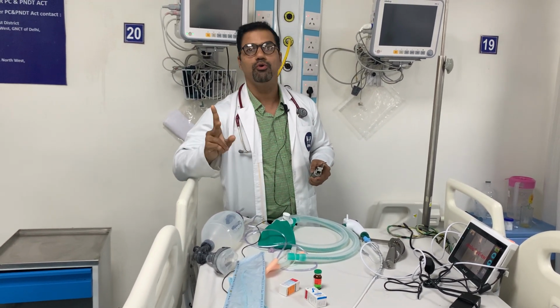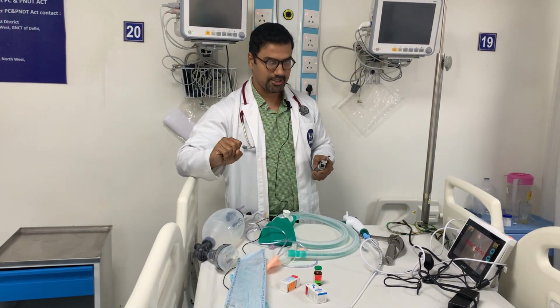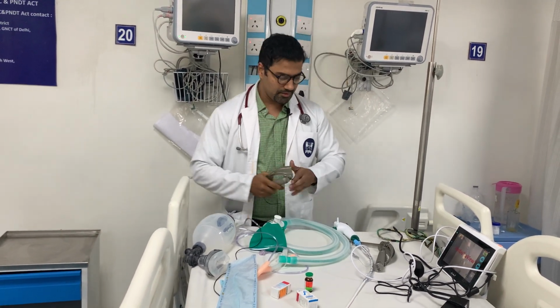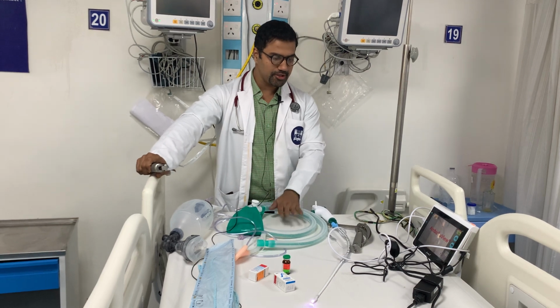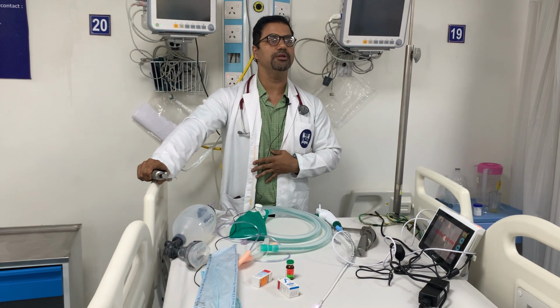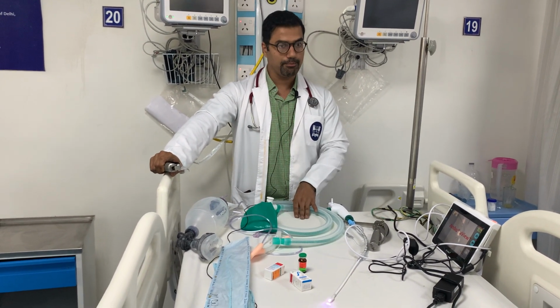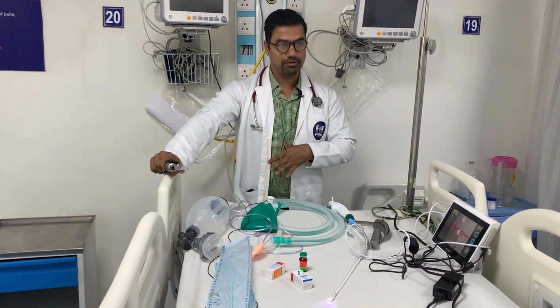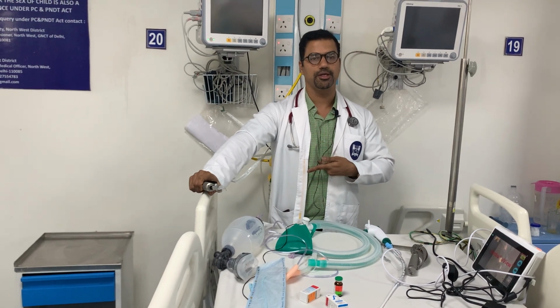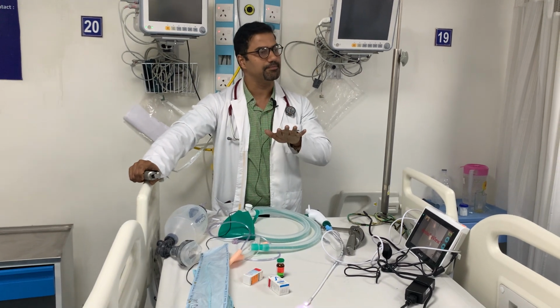So O. And last but not the least, N is for neck movement: whether the flexion and extension movement is adequate or not. Now coming to the position. Ideally, the position of intubation should be as high as possible. If we see the books, the bed should be at the level of the xiphoid process. Even at the maximum height of this ICU bed, I could not achieve that height. This should be your ideal height of the bed, not bending down and working hard for it. The height should be maximum.